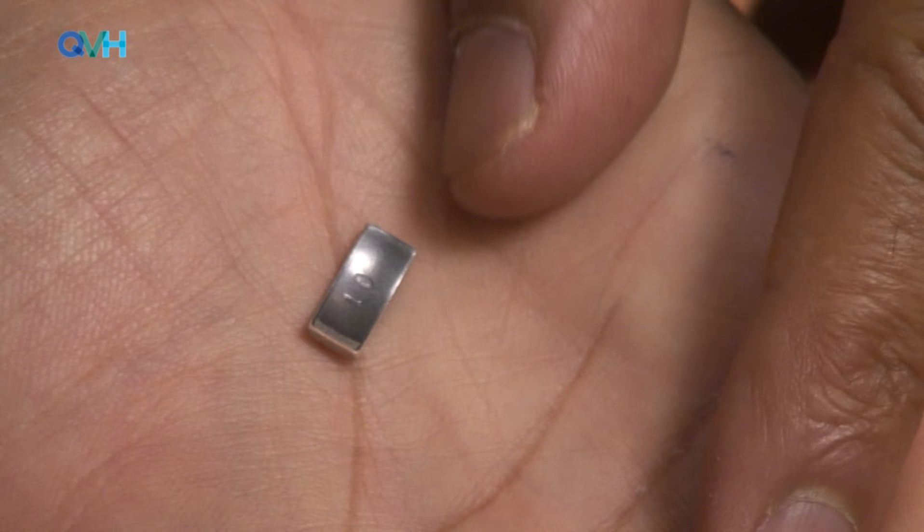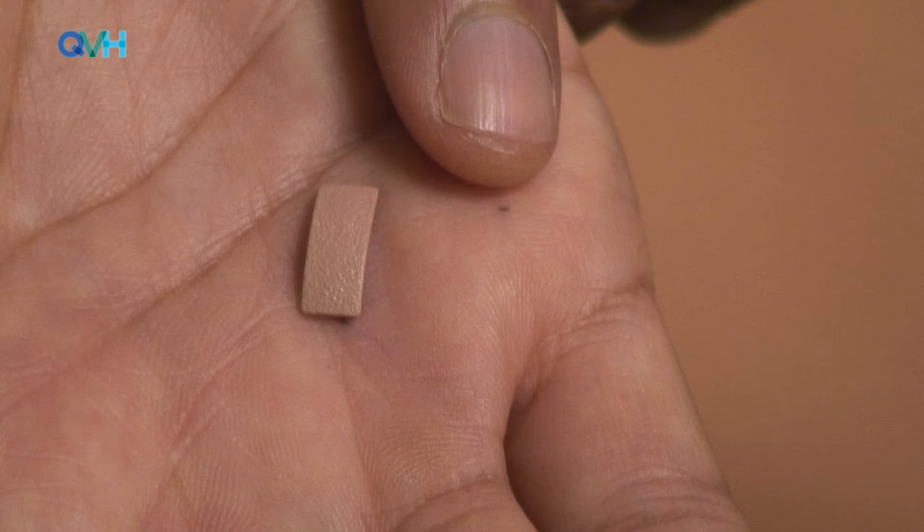In this instance, the patient expresses a preference for the one gram weight which was trialed initially. A 1 gram weight is therefore chosen. This is available in either pink or brown, so the pink coloured weight is selected as this matches the patient's skin colour. These weights are made of tantalum and can be produced by any local department that produces weights.